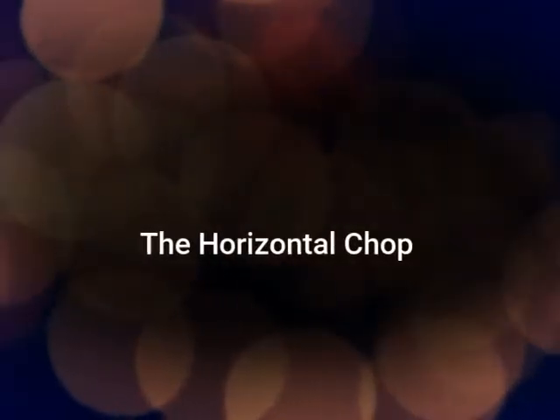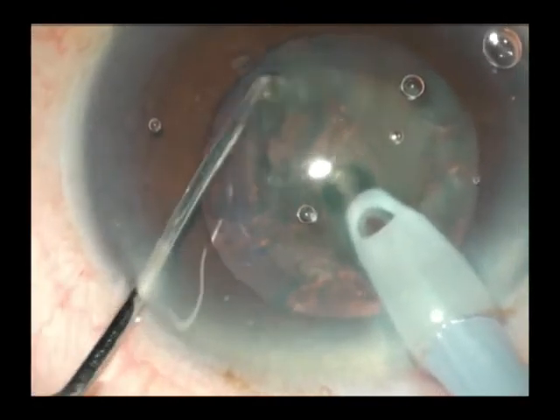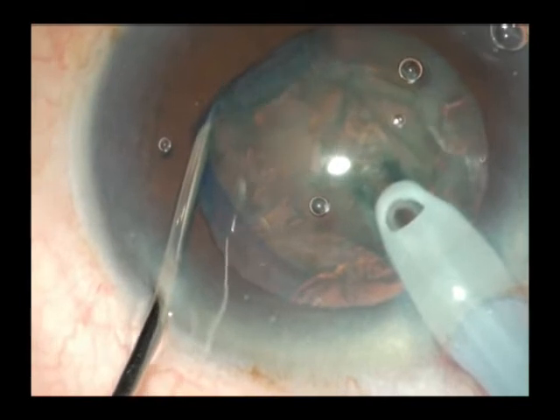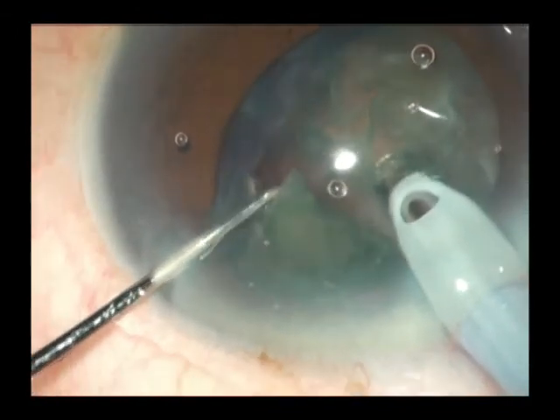Should you choose to emulsify these soft cataracts within the capsular bag itself, the horizontal chop technique is probably the best option. In this technique, a blunt tip chopper is passed deep to the rhexis, hooks onto the equator, and then is pulled towards the phaco probe, and both are separated resulting in an effective chop.